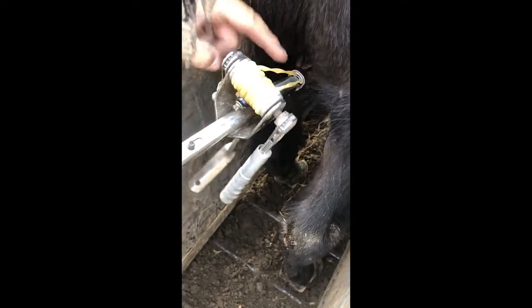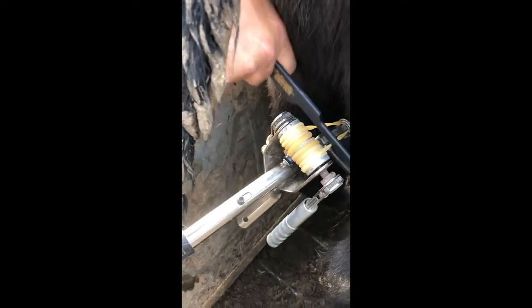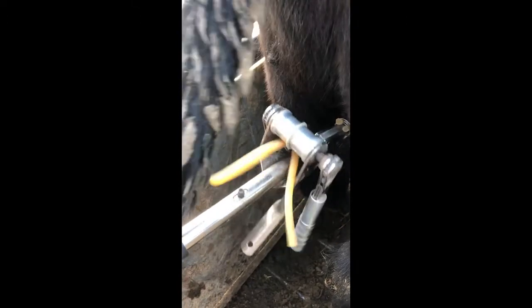We've got about four and a half wraps — that's usually a good indicator. Take our Calicrate cutter that comes with the kit and cut both of them at the same time. Now we have got that animal steered.